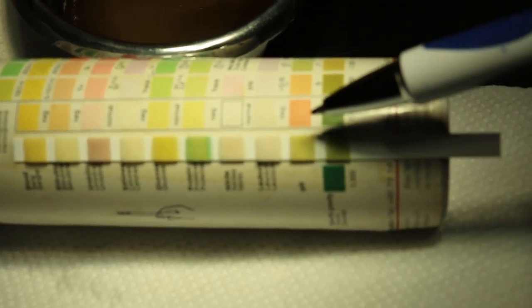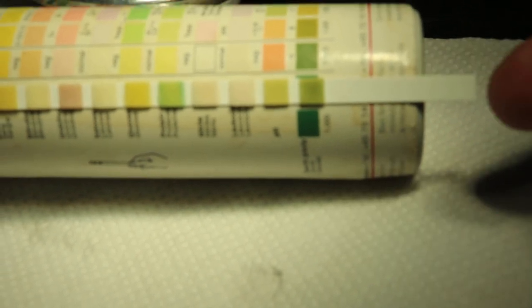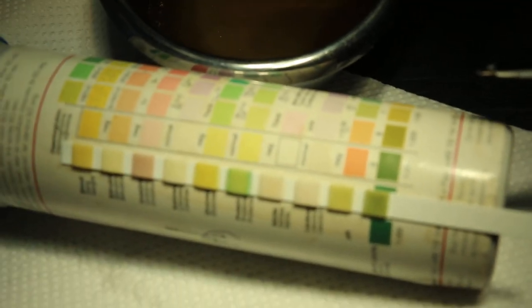Now FUS, now you see the nitrite, there isn't any also. Leukocytes is here, you don't see any pink, there's no. So a simple dipstick test will be more useful than anything else. The only thing I can confirm is the pH is about 7, the green, pH about 7 to 8. So the alkaline urine, and Science Diet CD would acidify the urine and prevent occurrence of this problem.